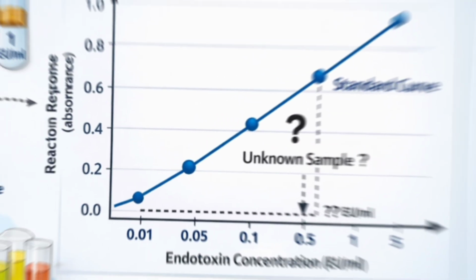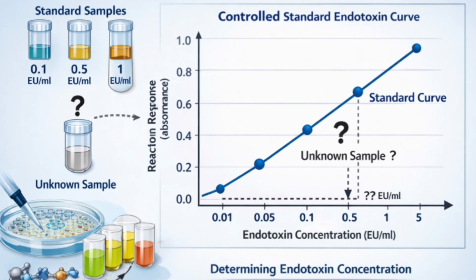The labeled lysate sensitivity test is performed by first preparing the standard curve with the controlled standard endotoxin. Standard curve is a tool. It acts as a known concentration of endotoxin that helps to find the unknown value of endotoxin units. So reconstitute the CSE and lysate with endotoxin free water.